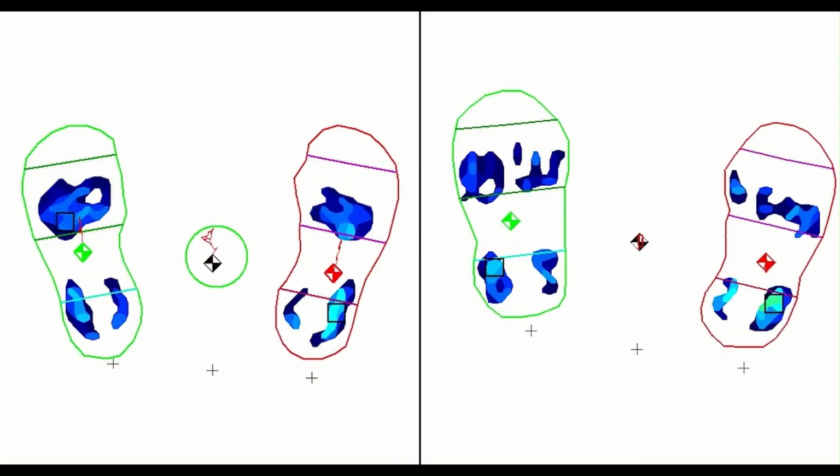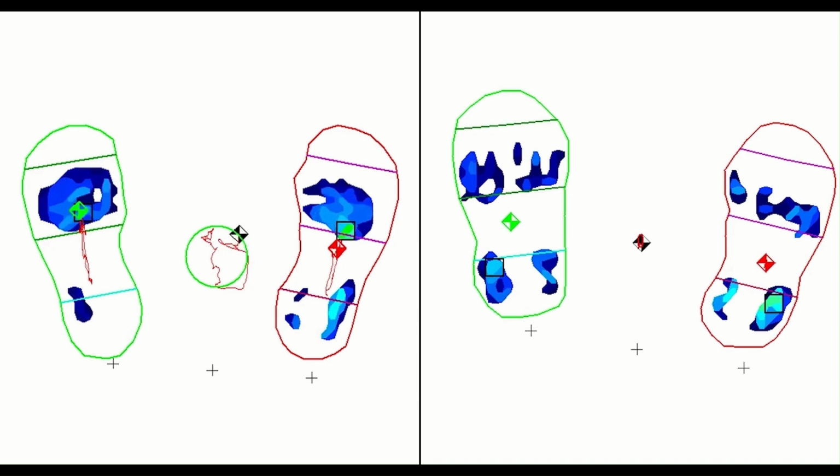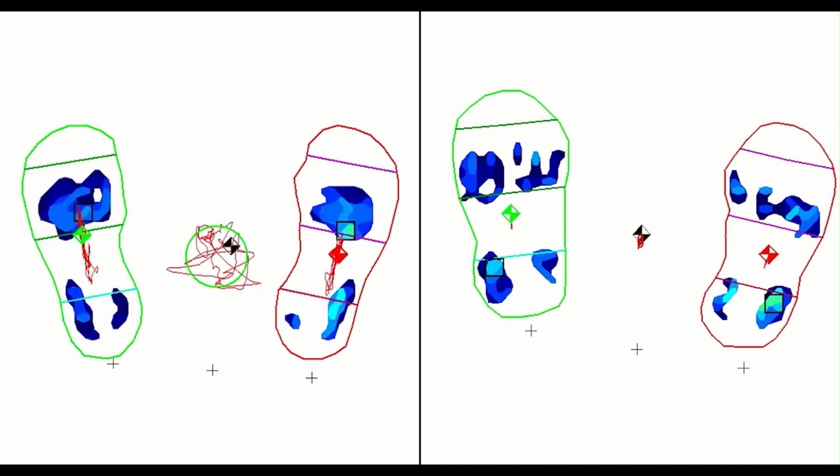This is the final picture, and this is the one we push and we show people. Here it is in real time. We're playing back the movie side by side of what occurred.